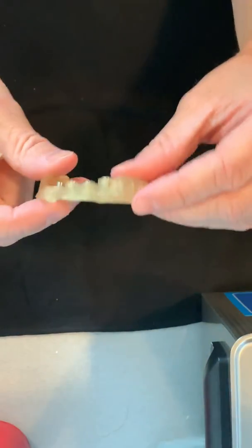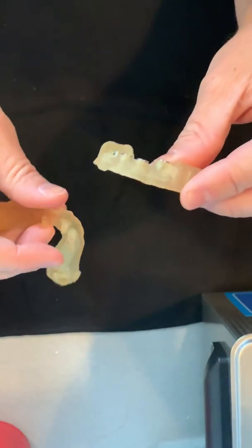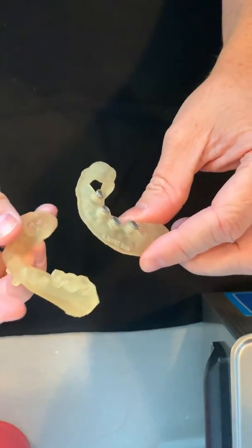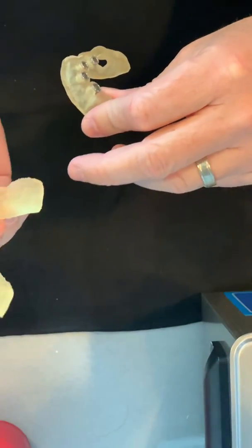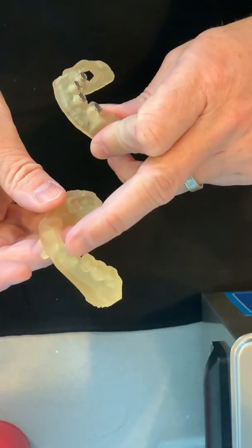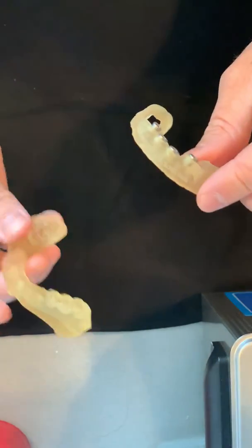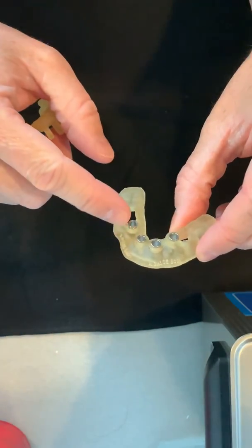I was going to make a post about what these were, but I figured it would be a lot easier to show you. So this right here is a model — it's hard to see, but these are teeth here. This patient is missing all of their front teeth, and this is a surgical guide that's going to show us exactly where we are going to place the implants.